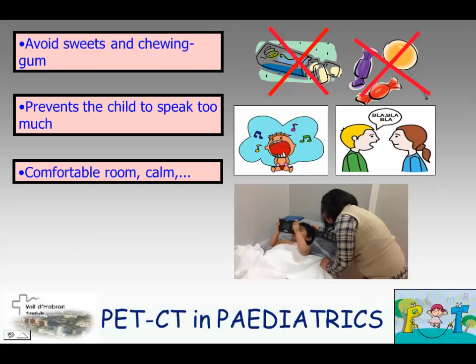Remember, avoid sweets and chewing gums, prevent the child from speaking too much, and try to have a comfortable room, calm for the rest of the children. Sometimes we have to use some toys or mobile phones, like here, because they rest more than without.